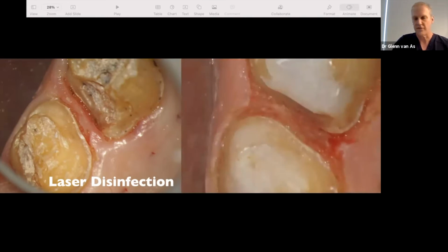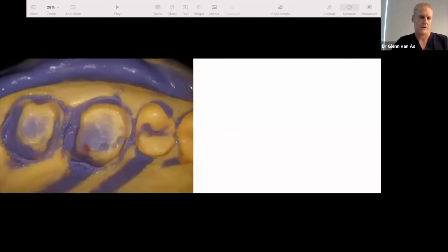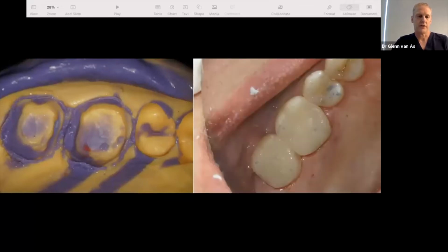And I have an iTero scanner that we just set up last week, so we're using it for ortho. I haven't actually used it for any restorative cases, so we're still using traditional putty and wash and full tray here, and some provisionals. So the laser was really helpful in allowing me to keep it dry for my core buildups and also for tissue management. And it's really a wonderful tool for tissue management, both in indirect and direct restorations.